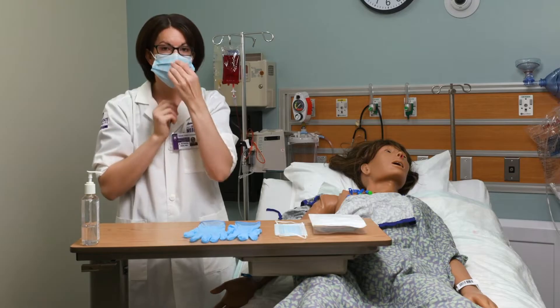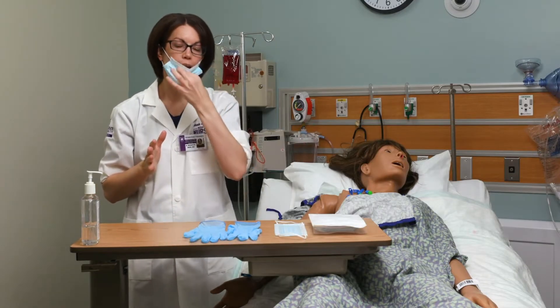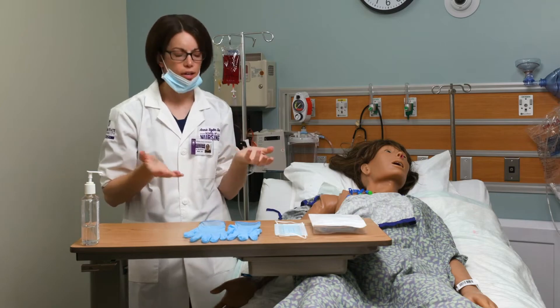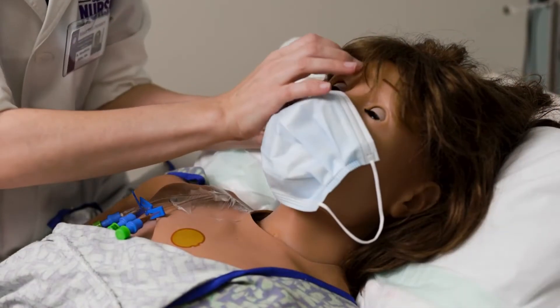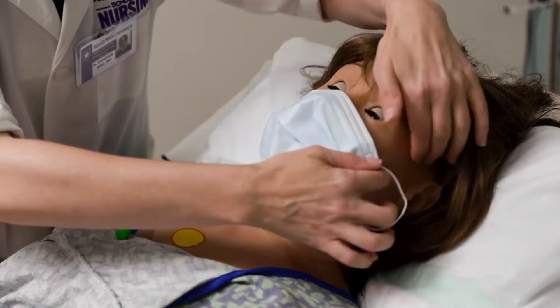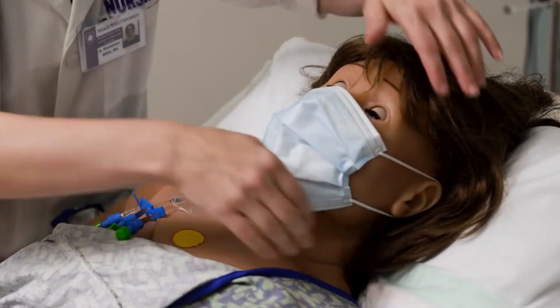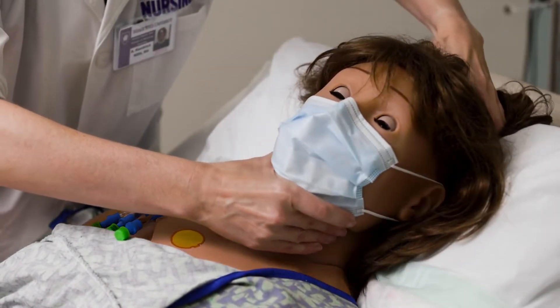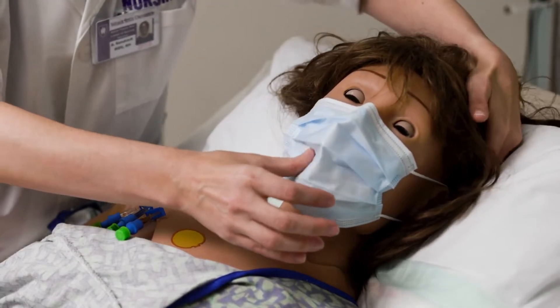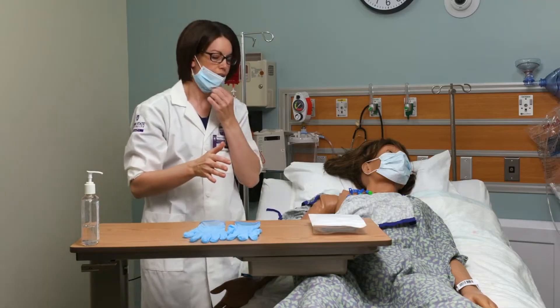For recording purposes I would keep my mask on all the way through, but I'm going to pull it down so you can hear me. I want to make sure the patient has a mask on so they don't accidentally contaminate the field of their central line once we've taken the dressing off. Then I'm going to have the patient turn their head away from the line — same thing, just to prevent any sort of infection to that line.